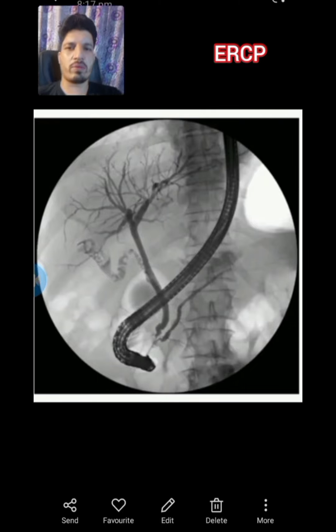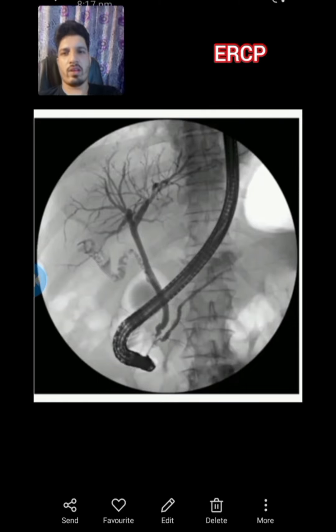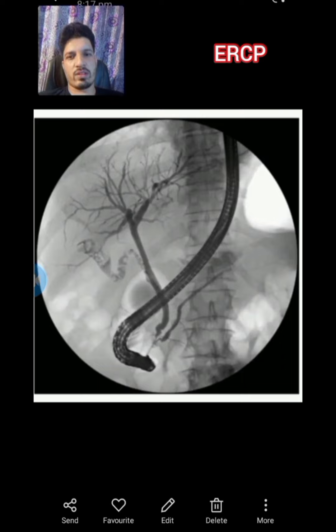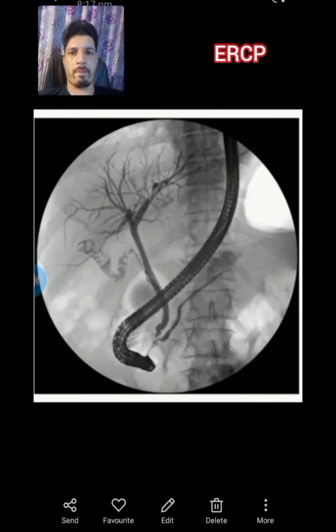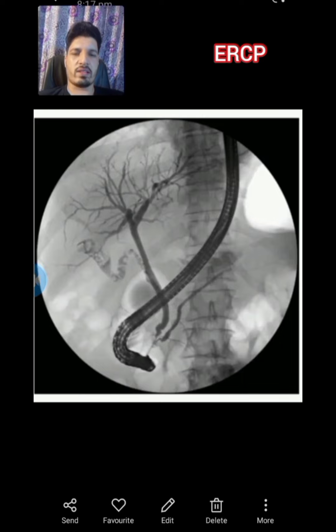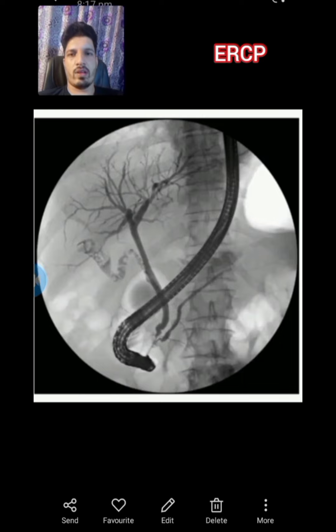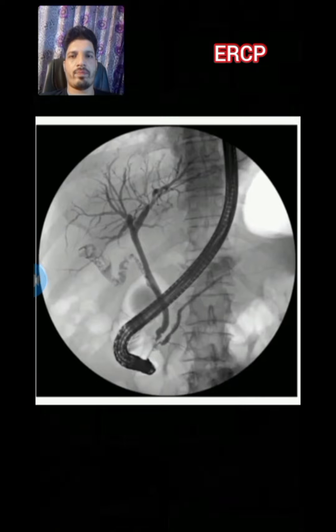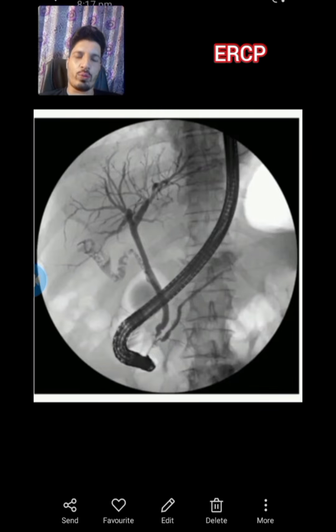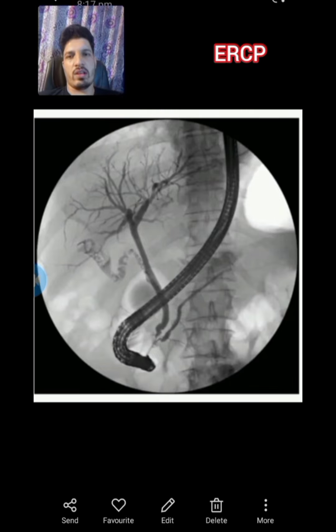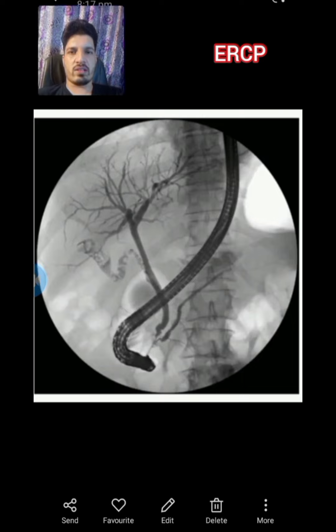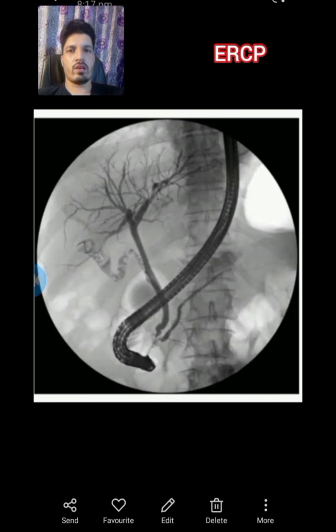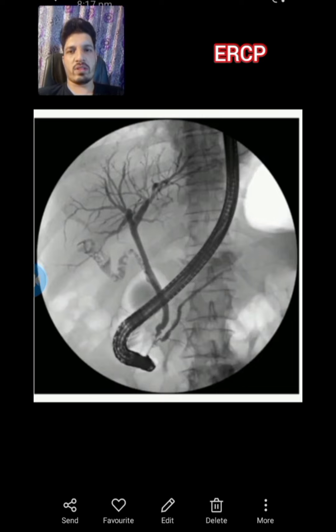Surgeon Dr. Amir Ghani is here. The investigation you are seeing on the screen is basically ERCP — endoscopic retrograde cholangiopancreatography. It combines endoscopy and X-rays to form images which are best used in surgery.